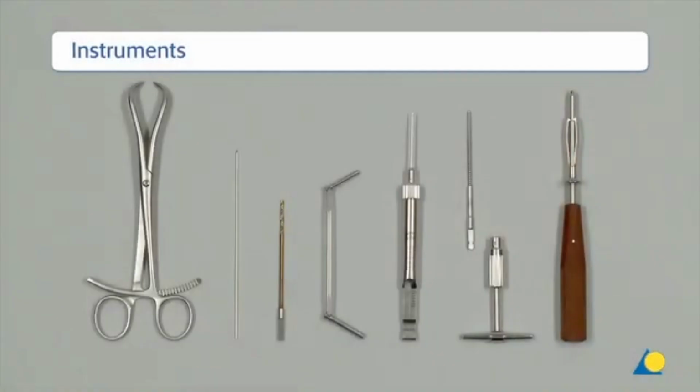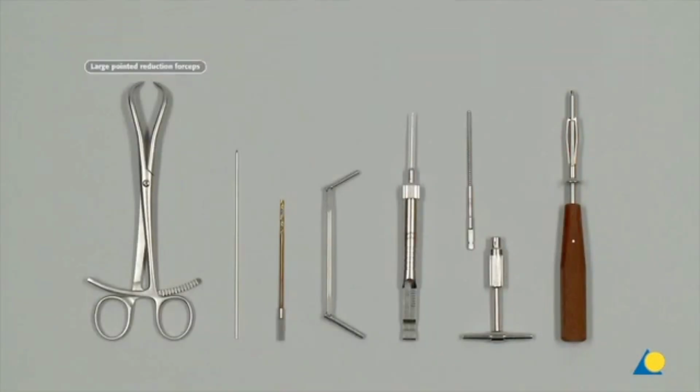The required instruments include the large pointed reduction forceps, the 1.6 mm K-wire, the 2.5 mm drill bit, the 3.5 mm universal drill guide, the depth gauge, the 4.0 mm cancellous tap, and the hexagonal screwdriver with holding sleeve.